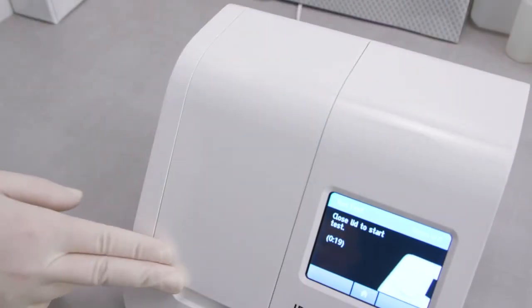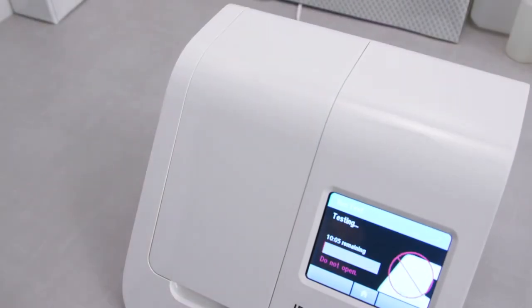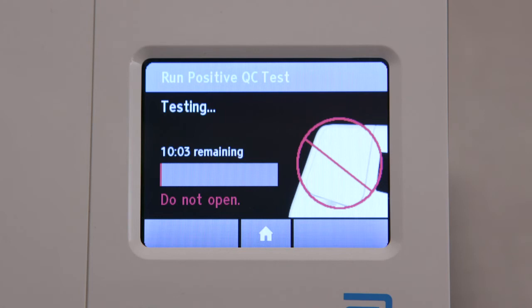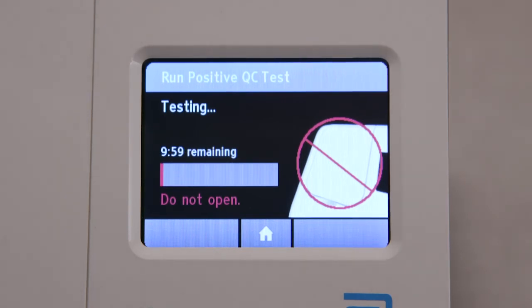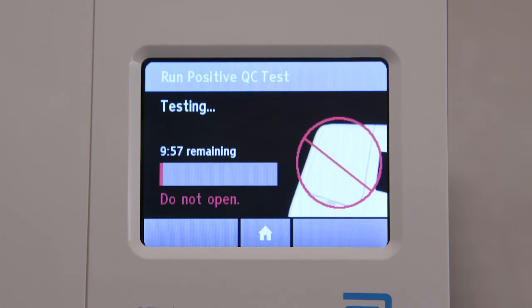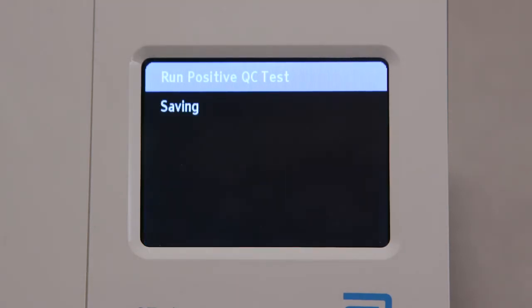The test will automatically start once the lid is closed and a countdown timer will begin. Do not open the lid or the test will be cancelled and all the test pieces will have to be removed and discarded. Once the test has completed, the instrument will automatically save the data before advancing to the test results screen. Do not open the lid until the test results are displayed.